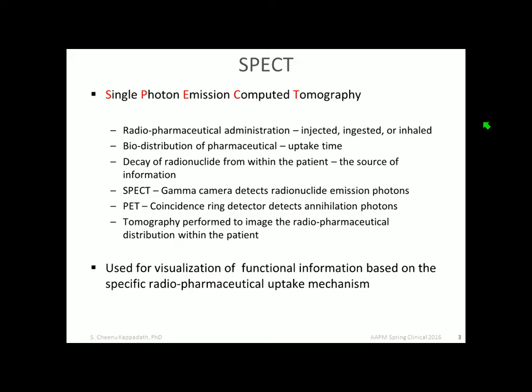If you do an MDP bone scan, we're talking about 120 to 180 minutes. It depends a little bit on the clinical practice. Obviously, as soon as you have administered the drug, there is decay going on, okay? While the biodistribution is occurring, the patient is radioactive.